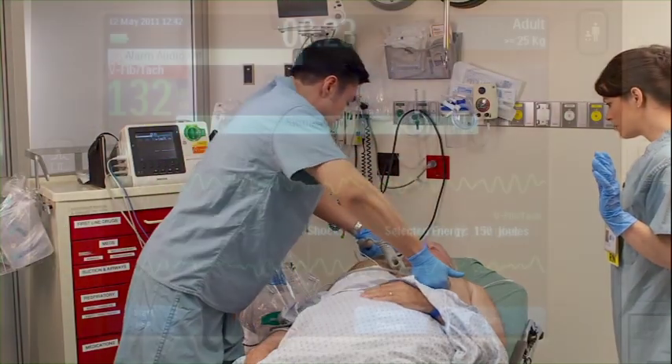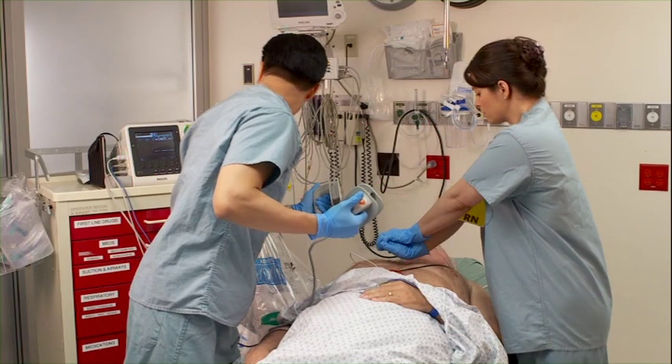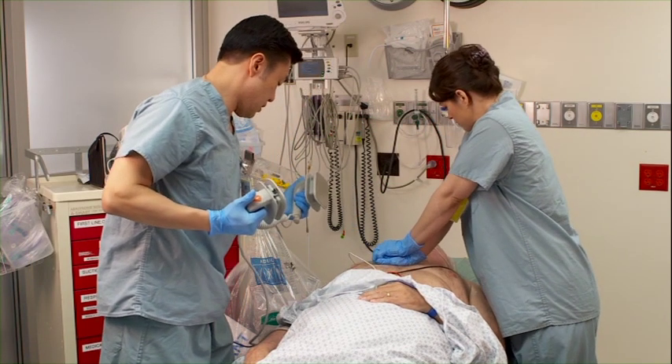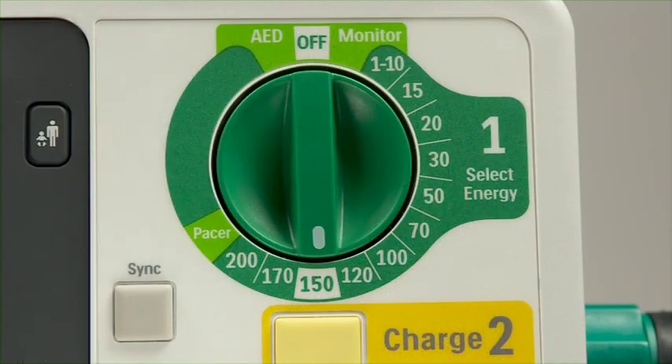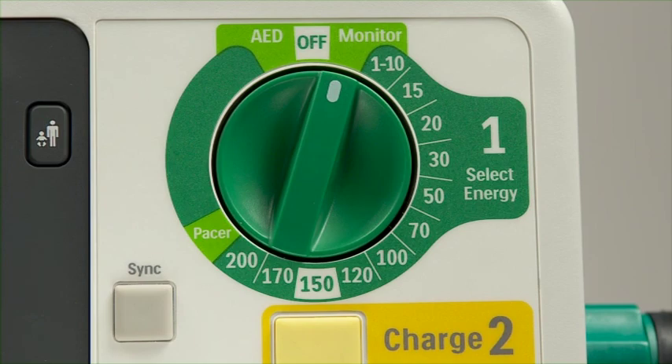Shock delivered. Begin CPR immediately per AHA guidelines following successful defibrillation, and after you confirm a stable heart rhythm, return the therapy knob to monitor.